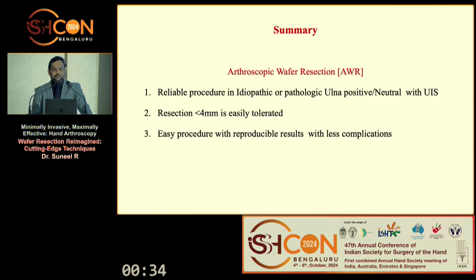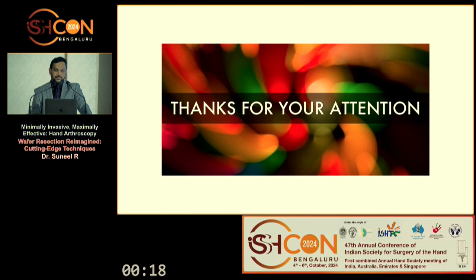So in summary, arthroscopic wafer is a reliable procedure in idiopathic or pathological ulnar positive or neutral variants in ulnocarpal impaction syndrome. Resection of less than 4 mm is easily tolerated, and it's an easy procedure with reproducible results and very few complications. Thank you.